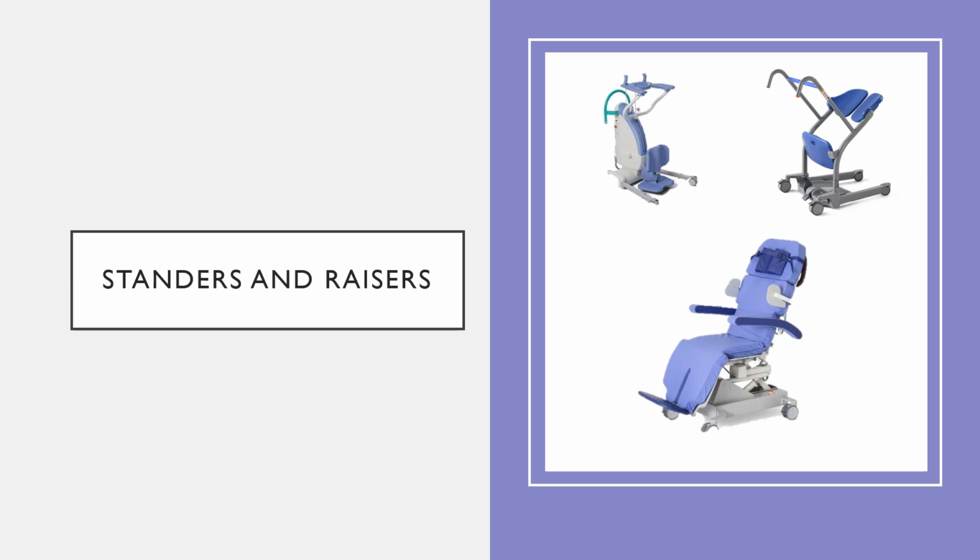Standers and raisers are designed to allow a patient to come to a standing position, often for early mobilization programs, but can also be used for patient care tasks or transfers. Manual standers often require the patient to have the ability to sit unsupported and to be able to come to at least a partial stand with or without assistance.